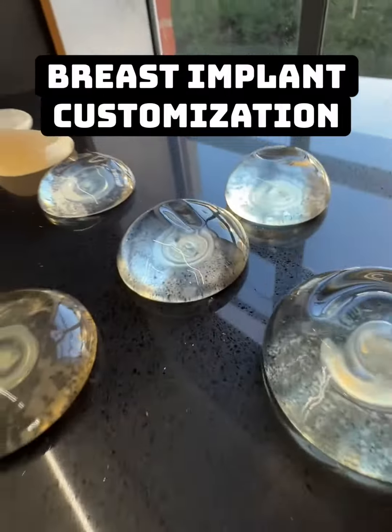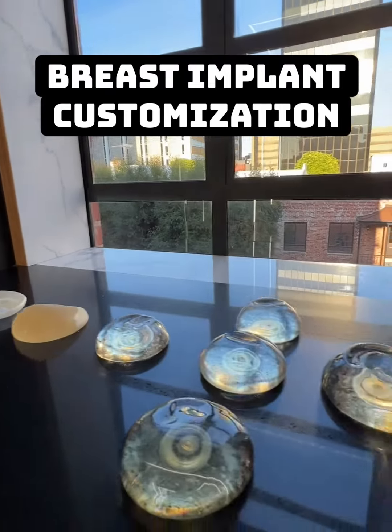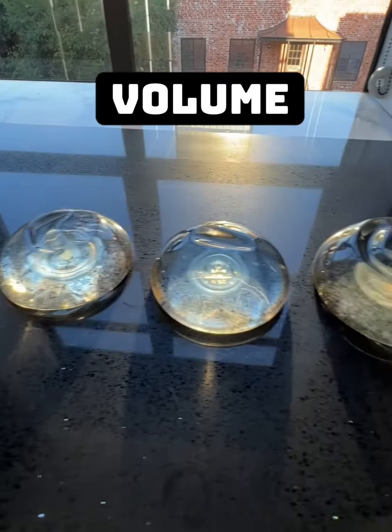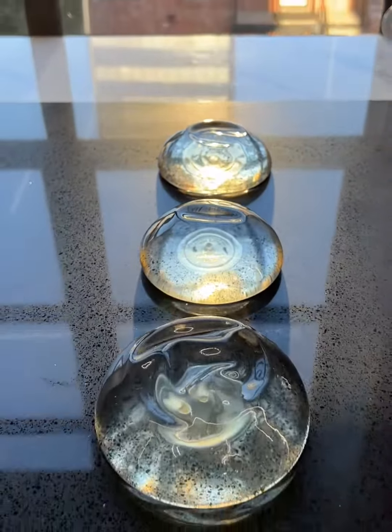Breast implants have several variable factors that allow patients to customize the look and feel of their augmentation based on their aesthetic goals. First is volume. Here you can see implants that range from 300 to 450 cc's in size. This is how we control moving up in cup size of the breast.